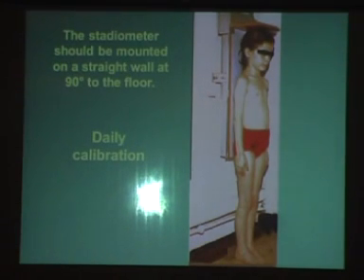And this is the correct way to measure the standing height in centimeters, and daily calibration is very important.